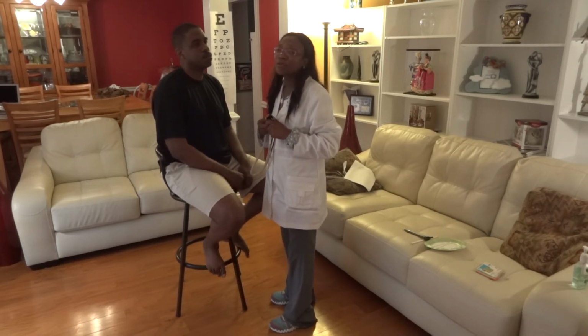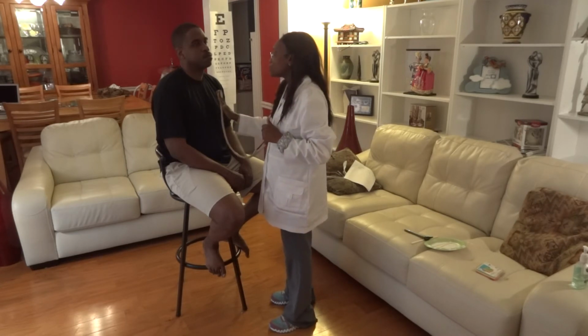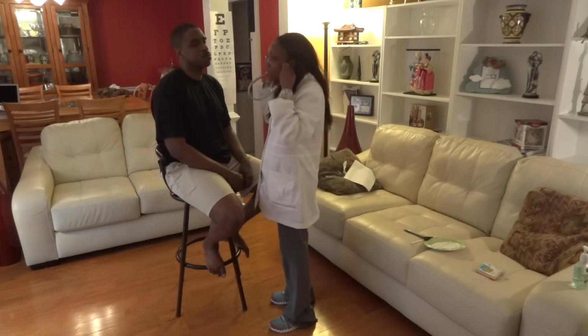Now I'm going to use the bell of my stethoscope to assess for any bruit, temporal artery bruit, carotid bruit. I'm also going to assess the thyroid for any bruit, and I'm also going to assess the chest, the cardiac area, for any extra heart sounds such as an S3 or an S4.